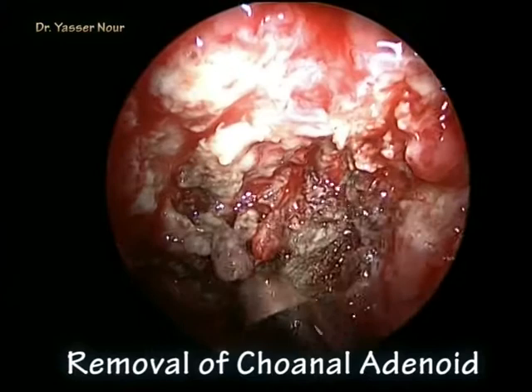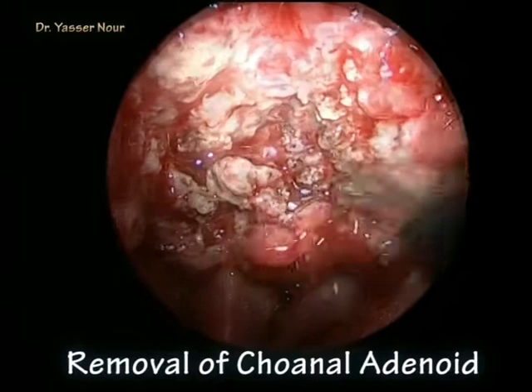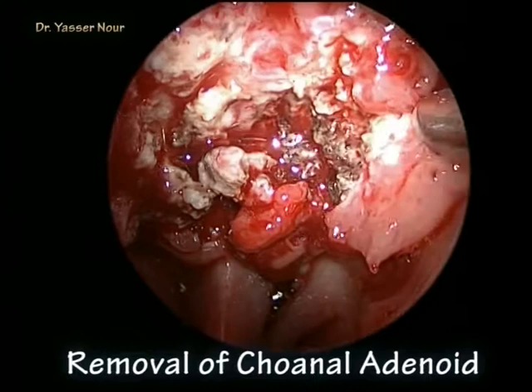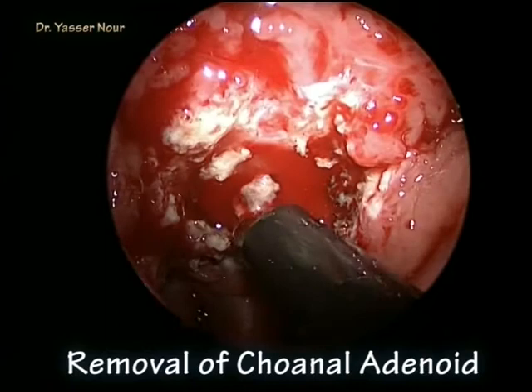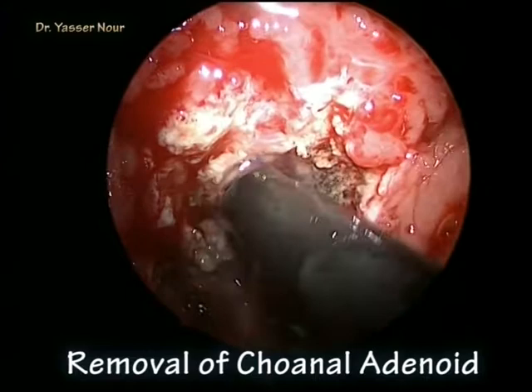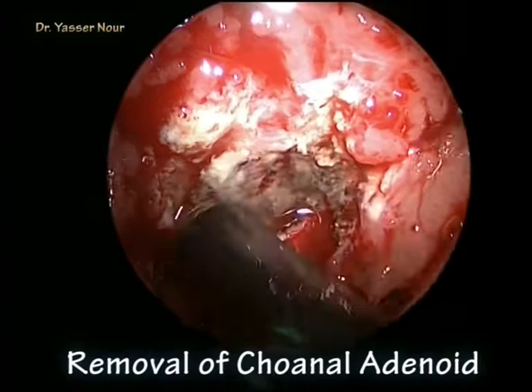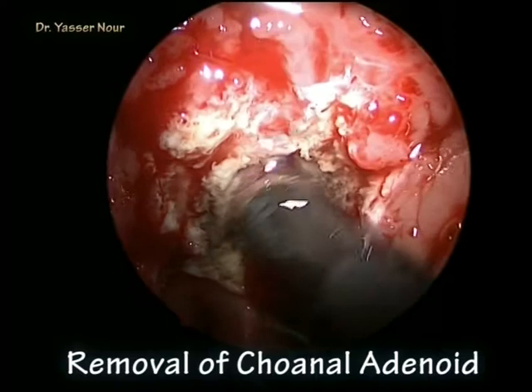Here you can see the choanal part of the adenoid. In the depths of the field, you can see the posterior end of the vomer, and this is the choanal portion of the adenoid. You can now see clearly the posterior end of the vomer and the posterior end of the inferior turbinate. This choanal portion must be removed to ensure adequate breathing and avoid any risk of re-bleeding. Sometimes the wand needs to be bent more to reach this area, allowing complete removal under visual control.